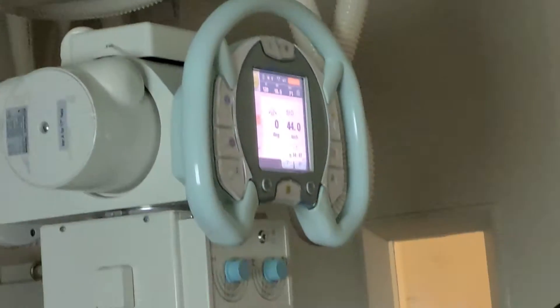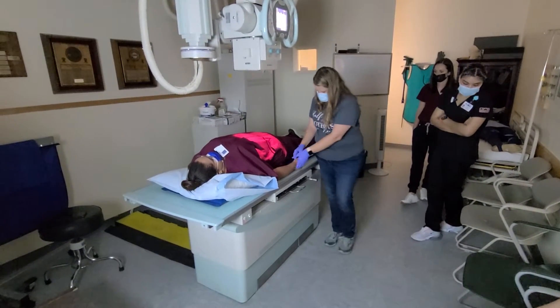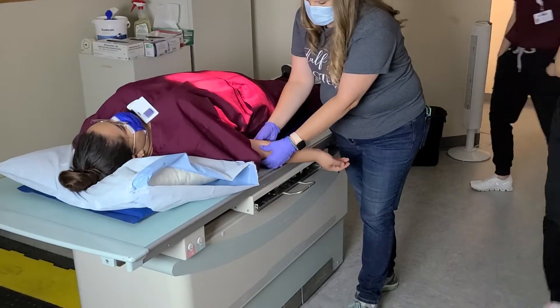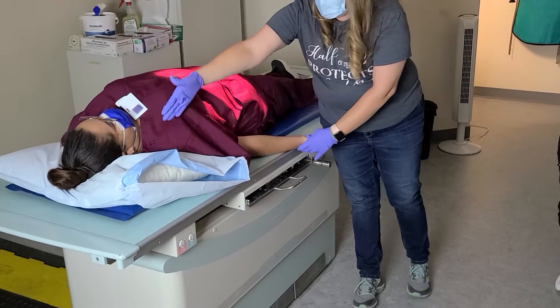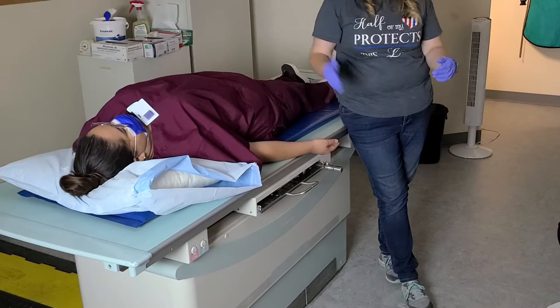No longer touch your bucky or your camera after that. For our AP, we're going to turn the hand so it's supinated so that the condyles are parallel. Now if you look when they're laying down, the shoulder is here and the elbow is way up here — so they're not in the same plane.